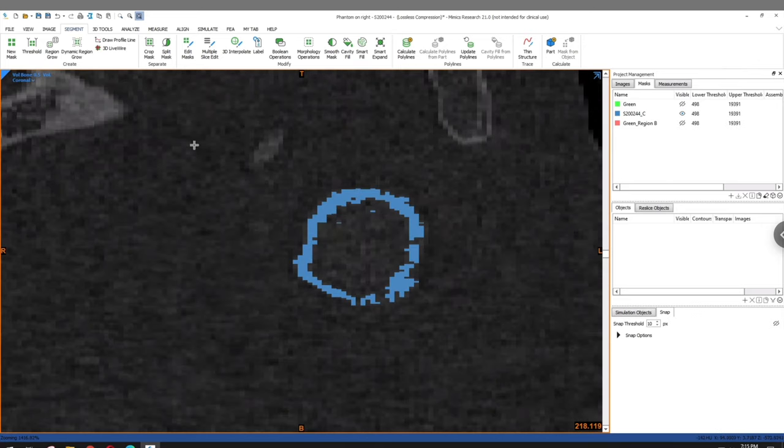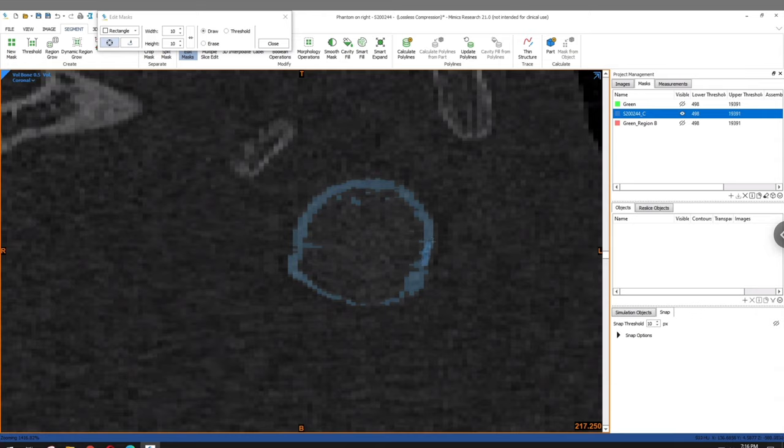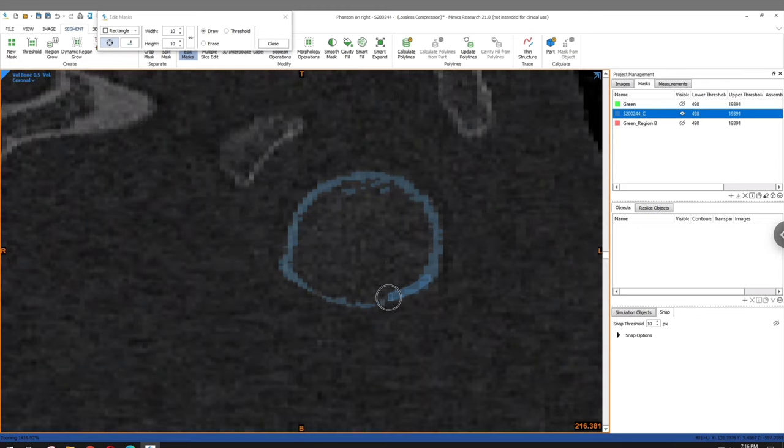As you can really see here, unfortunately, our cortical shell model is nowhere near complete. There are many voids still within our model, and those will make any kind of attempt to create a functional 3D model impossible within the context of trying to differentiate between the cortical shell and the trabecular inside of the humerus.